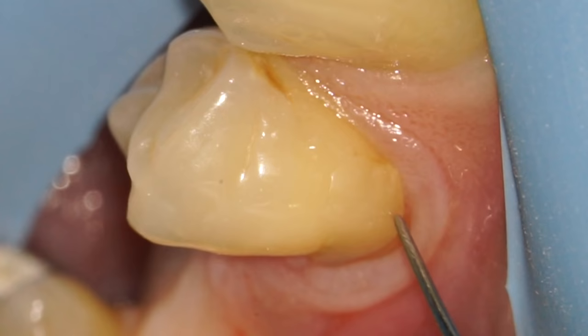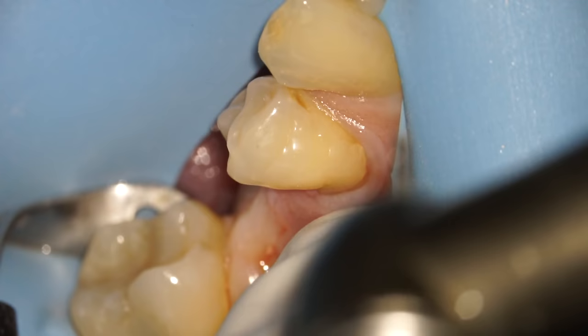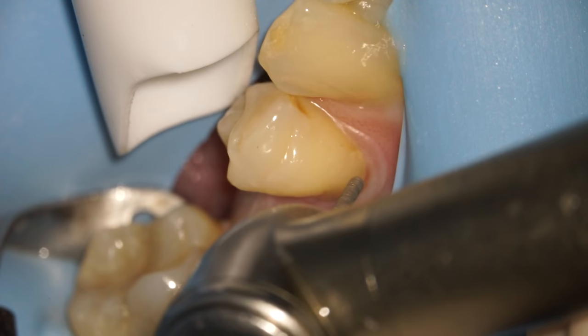Here you can see that someone's actually attempted to fill this area before, but underneath is an open margin — an area where bacteria can sneak in and cause problems.